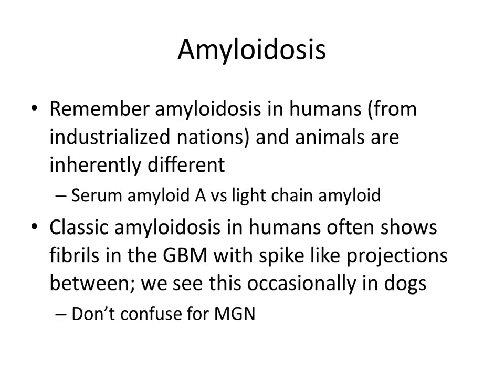And then the other discussion is that sometimes, and this is something that we see consistently in humans, and we've seen it in maybe 5 to 8 dogs in the IVRPS system, the amyloid actually starts to get deposited in the glomerular basement membrane, and then there are these spike-like projections in between. On the JMS stain, you can actually see spikes on the glomerular basement membrane, and you might confuse it for a membranous pattern, or a response to immune complexes. I'll show you what that looks like.